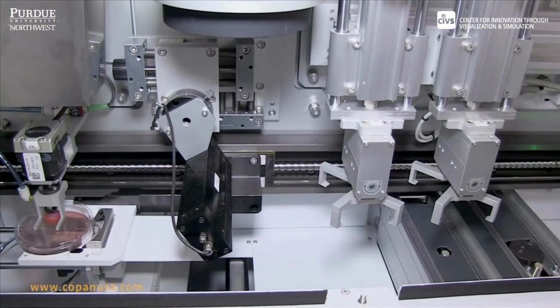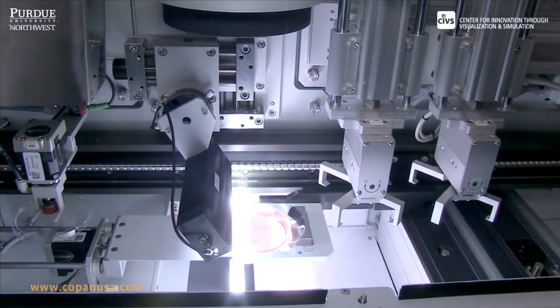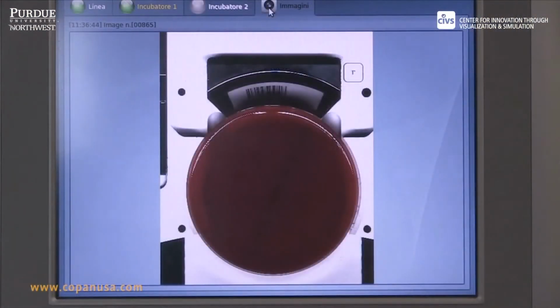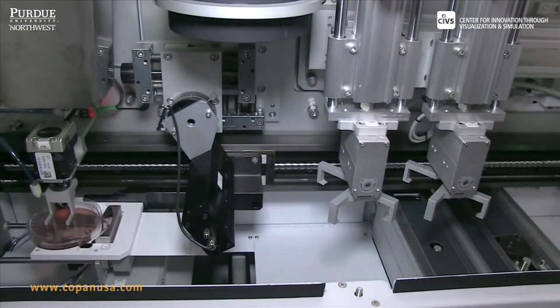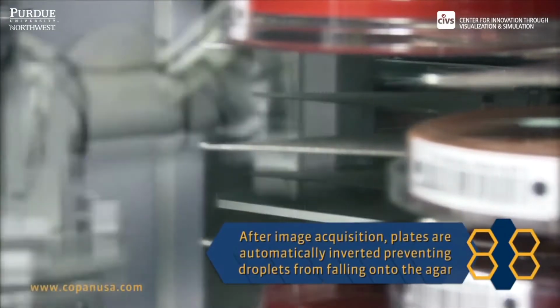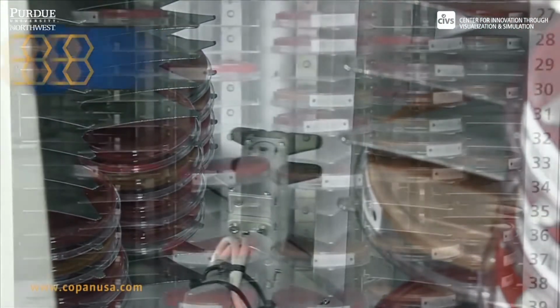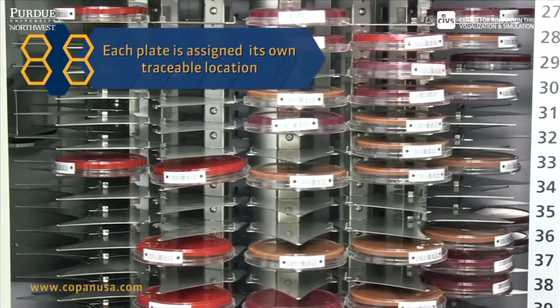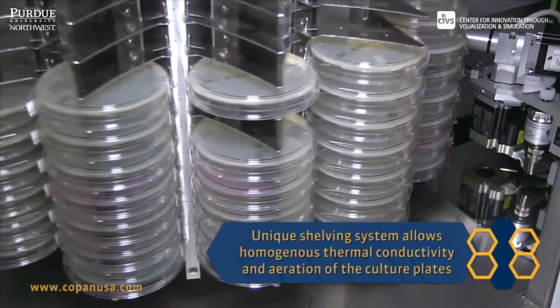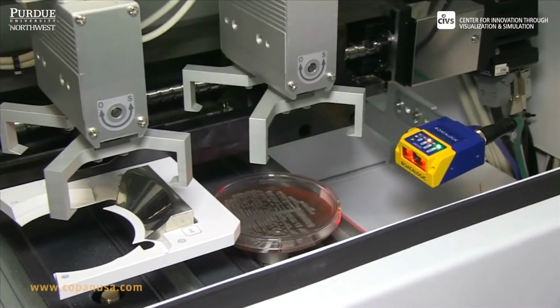Before they are placed in the incubator, a high-resolution camera takes a picture of the surface of the plate as a reference to compare to future pictures. After posing for a photo, the plates are transferred into the incubator, which is maintained at the temperature, humidity, and carbon dioxide level for optimum bacterial growth. The incubator is programmed to remove the plates at specified times to detect changes in the surface of the media that would indicate the start of growth of bacterial colonies.